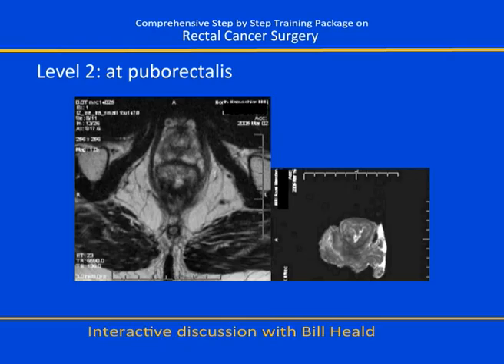We can see them, or we can certainly follow them down as far as the area behind the prostate and the neurovascular bundles there. I think at the level of the puborectalis it is a challenge for us to see them because they're of the order of millimetres, sub-millimetre diameter, so it may be difficult for us to resolve those. The vessels you'll see, because the nerves have all broken up by then into little ones. Yes.